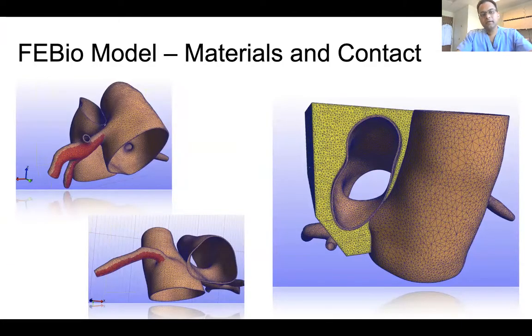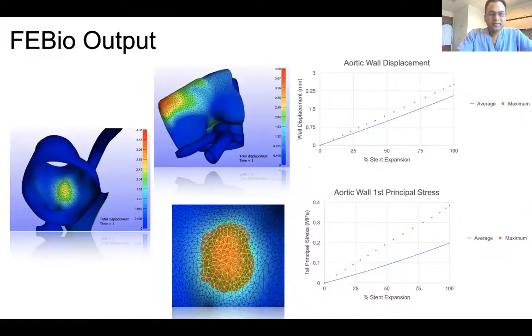So they fixed the coronary arteries as shown in the red on the left, and then added the adipose tissue in between the blood vessels, and then enlarged the pulmonary artery in the area of the stent, and measured if there is any aortic root displacement or stress on the aortic wall or the coronary arteries. And as you can see in this case, they predicted that there is significant stress on the aortic wall as well as aortic wall displacement.